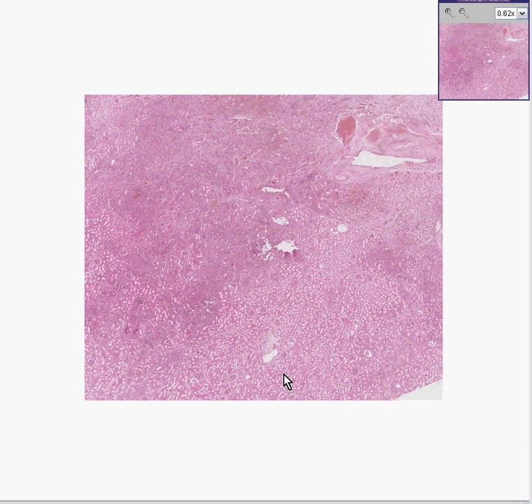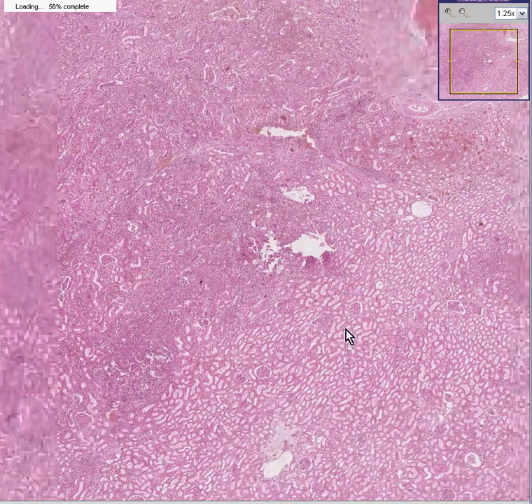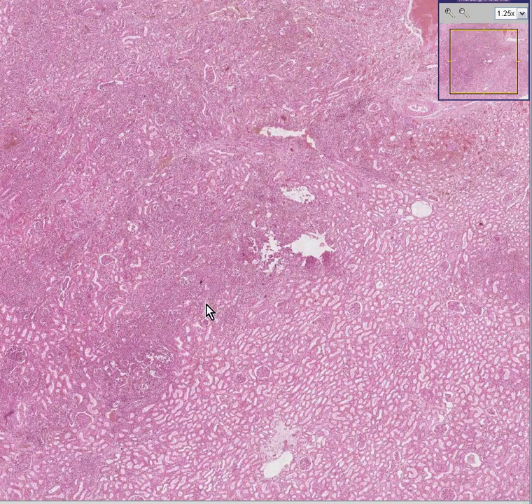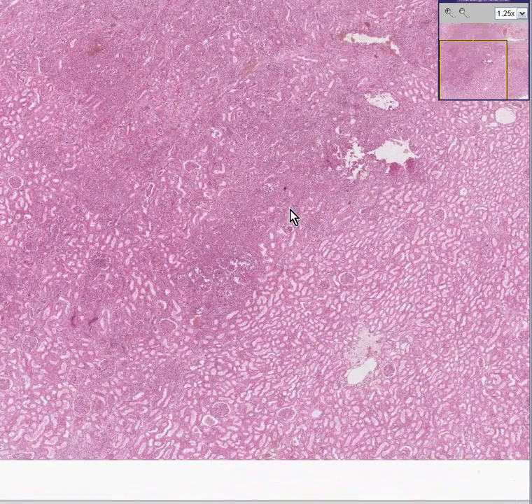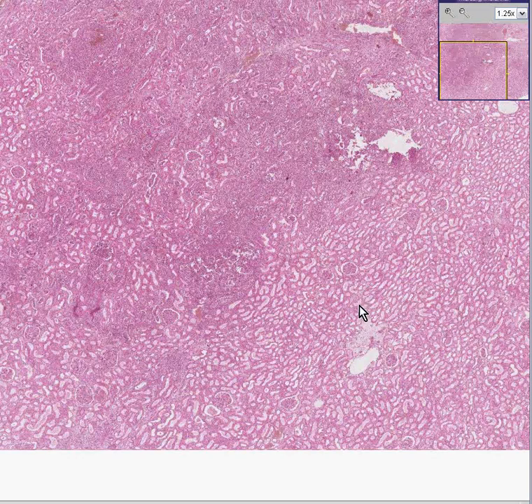Because these lighter areas represent open tubules, you're probably not too interested in that. And you want to go instantly to this area here, where the tubules don't look open, compared to here, where the tubules are open.